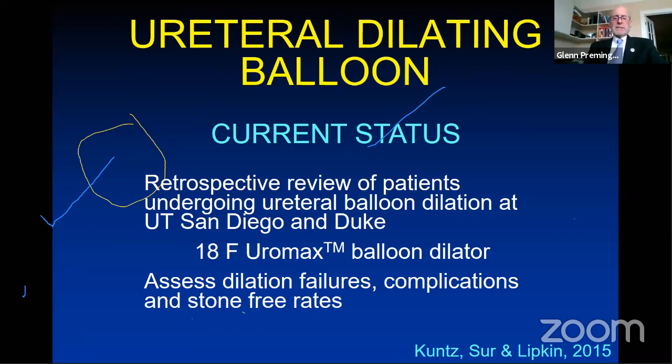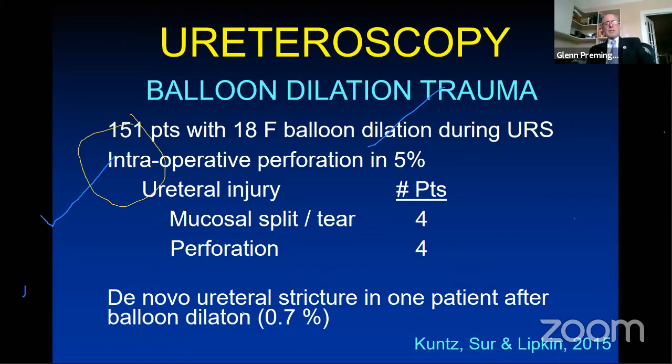These are data from a retrospective study that we performed at Duke in partnership with the University of California, San Diego in 2015, where we identified over 100 patients who had undergone ureteral balloon dilation, and we assessed the ability to dilate the ureter, complications, and stone-free rates in these individuals. And in 151 patients that had undergone balloon dilation with an 18 French balloon, we found the incidence of intraoperative perforation only in 5% of the patients.